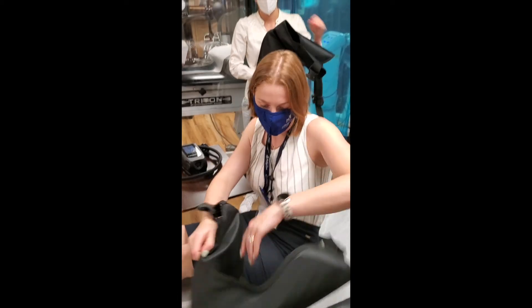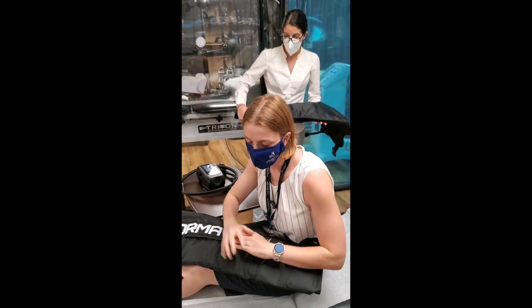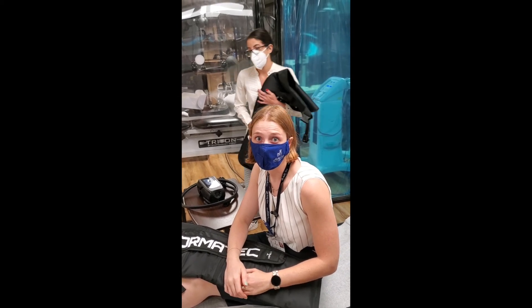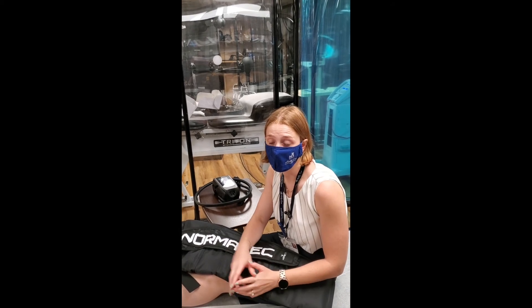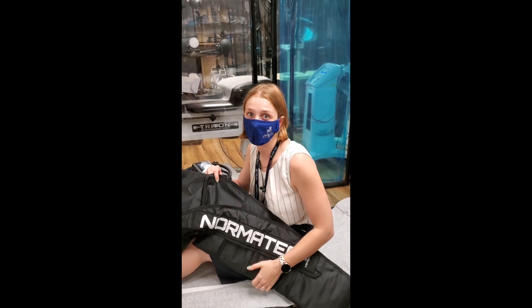It slides off and the patient can assist. I haven't had to change my clothes or change my position — I can just lie flat and let the treatment help me. Tune in more as we continue to post updates on how we're doing with our equipment. This is one fantastic piece of equipment and I encourage everyone to come and try it. Thank you everyone, and thank you Steph.